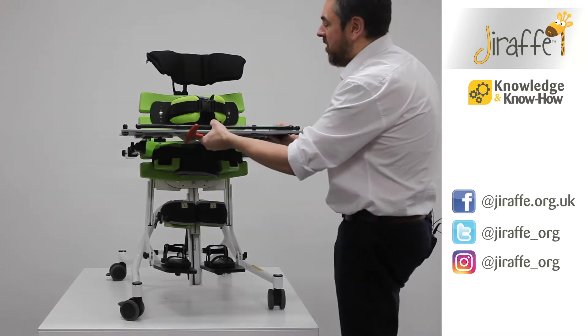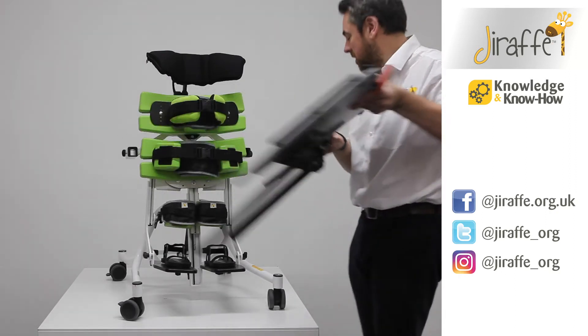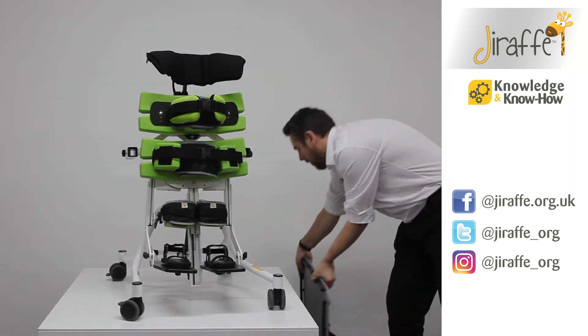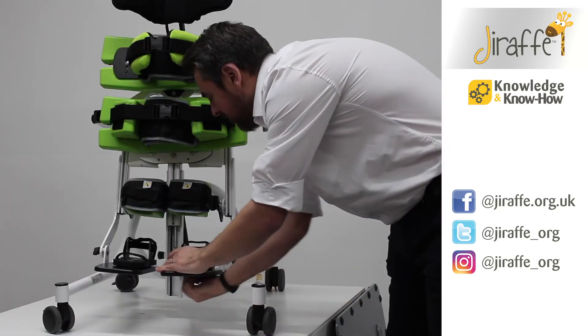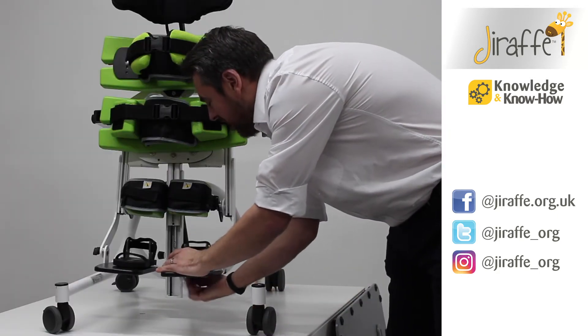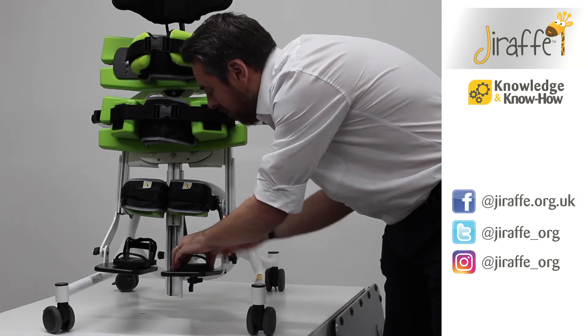The first thing we're going to do is remove the tray which has been set in the supine aspect, place that to one side, and then we're going to want to rotate our sandals round by 180 degrees by simply loosening the wing knob at the bottom.